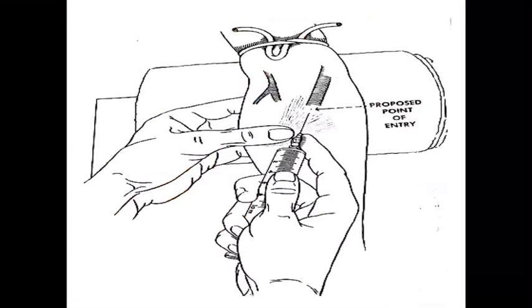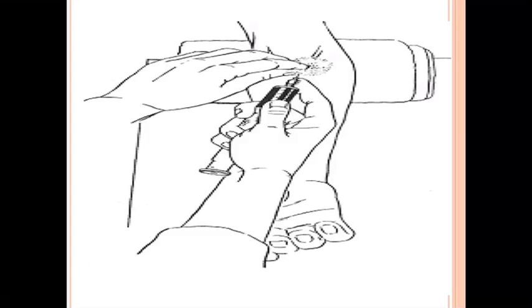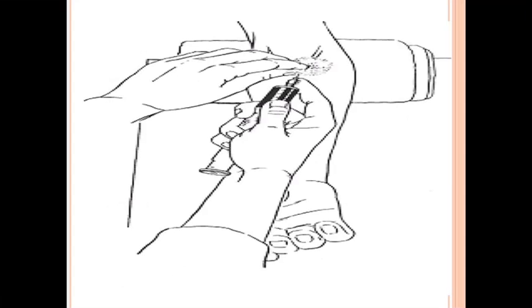So this is all about the collection. After the collection, we loosen the tourniquet immediately. Then apply the cotton to the puncture site.